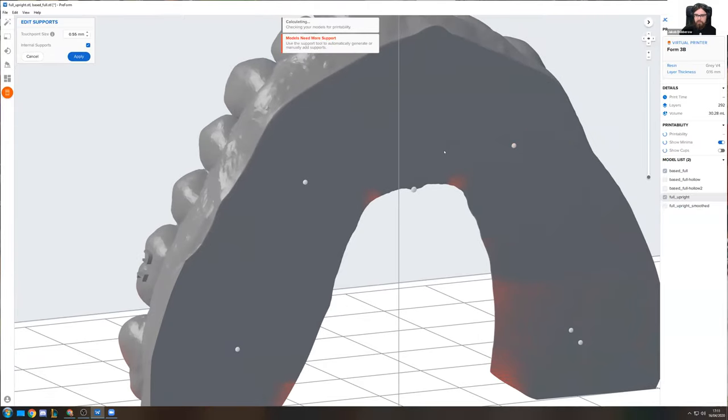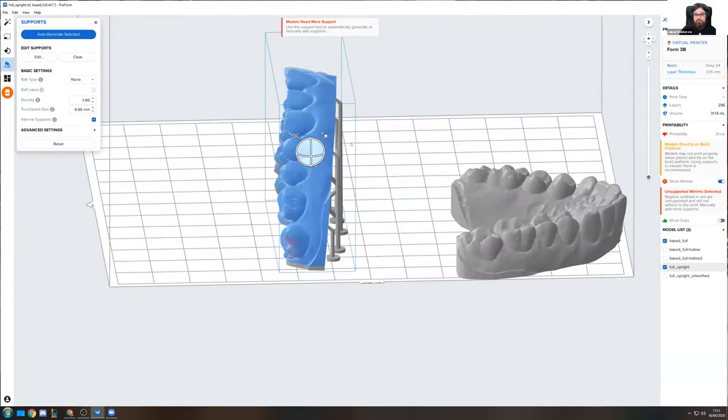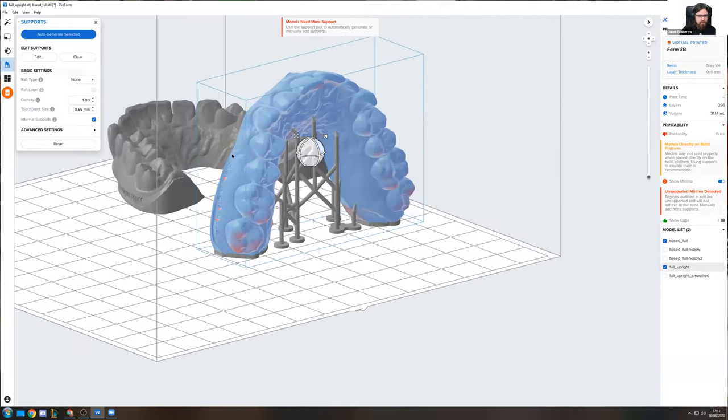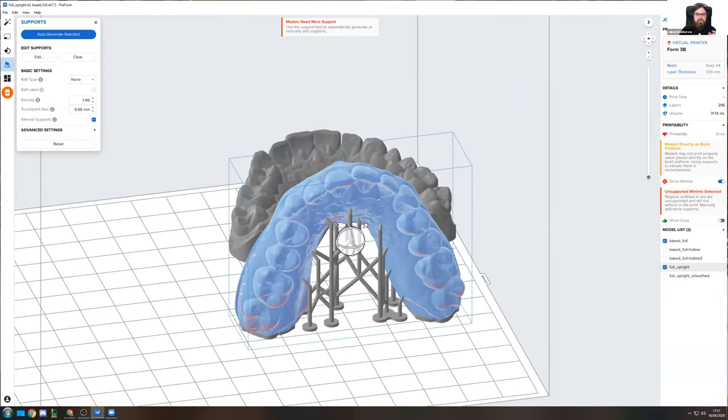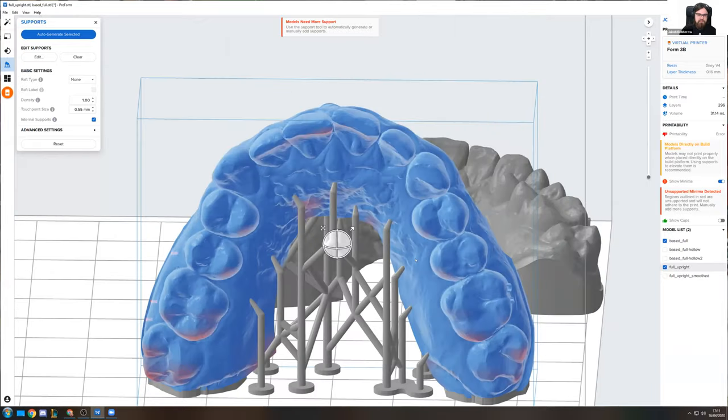We'll just add a couple more from what, in my experience, would be a good and sufficient amount of supports. I'm still seeing some minimas right here, which I would have to take care of. I'm skipping it right now, but you really shouldn't for printing purposes. But you can generally see how few supports I have here, so this is much easier for me to take care of.